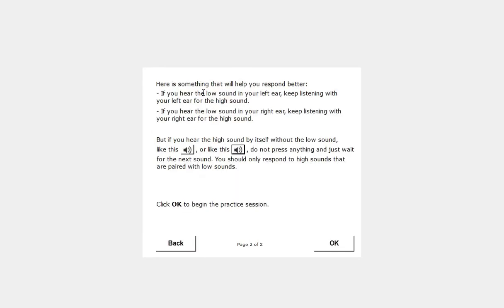Here is something that will help you respond better. If you hear the low sound in your left ear, keep listening with your left ear for the high sound. If you hear the low sound in your right ear, keep listening with your right ear for the high sound.